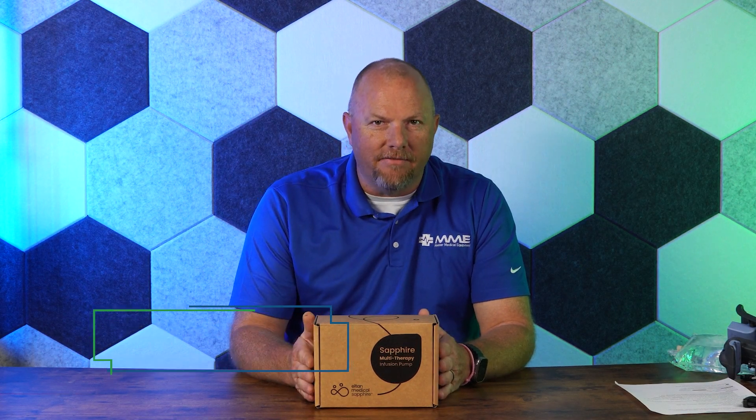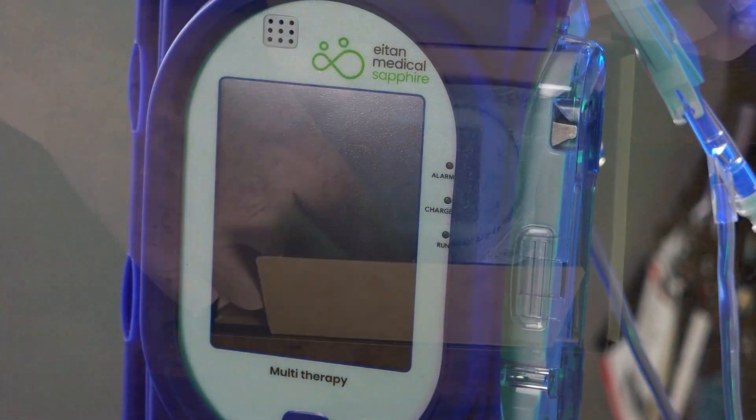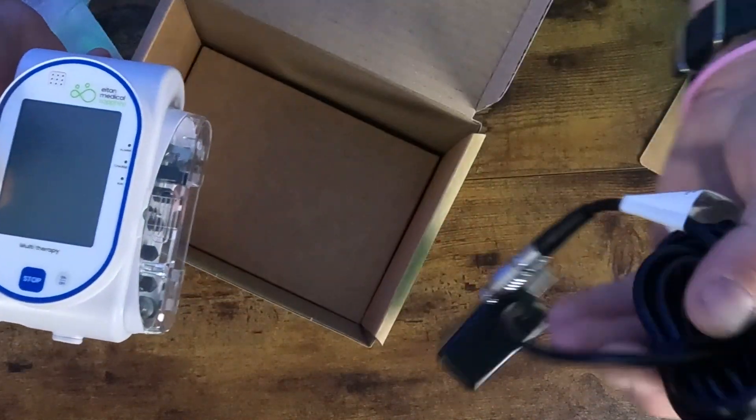Hey guys, Trent Harris with Master Medical Equipment going to do a quick unboxing of the Sapphire infusion pump by Zyno Medical and go over a few of the features and benefits of this pump — an excellent pump for EMS and the transport world. Inside the box it's pretty simple: you've got the pump itself and a charging cord.